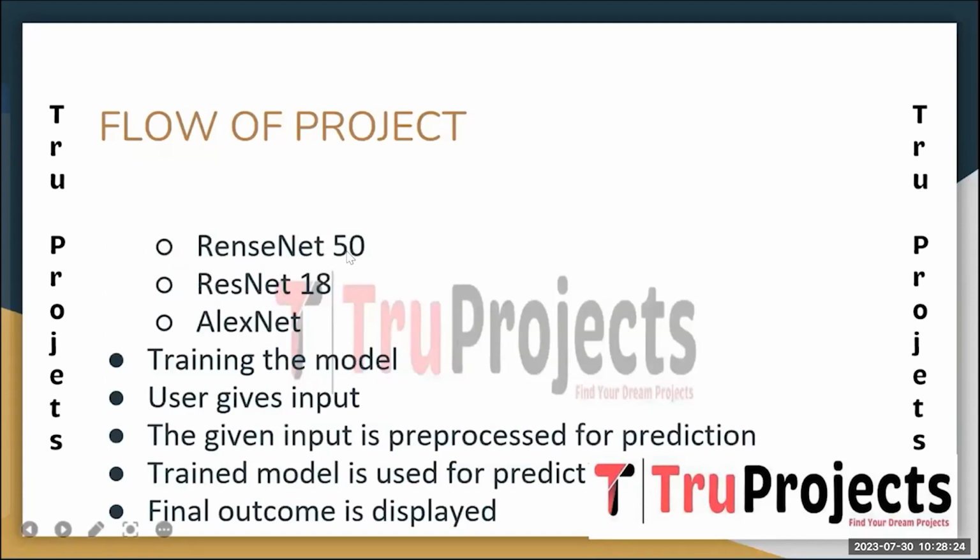And the third one is ResNet 50. ResNet 50 is a popular variant of the ResNet architecture which introduced the skip connection to address the vanishing gradient problem. This design allows for deep networks while avoiding degradation issues. ResNet 50 has demonstrated remarkable performance on various computer vision tasks and is widely adopted for image classification.